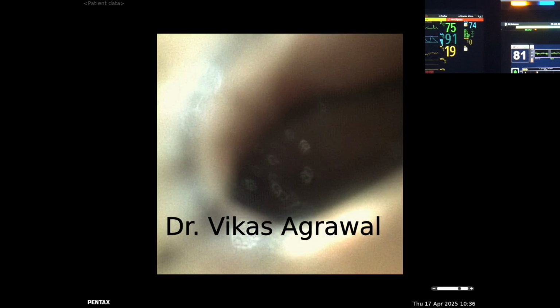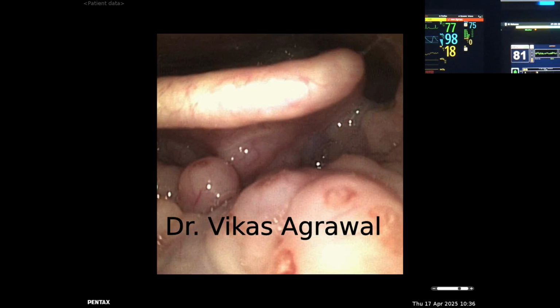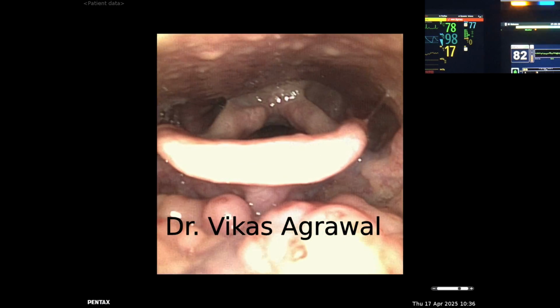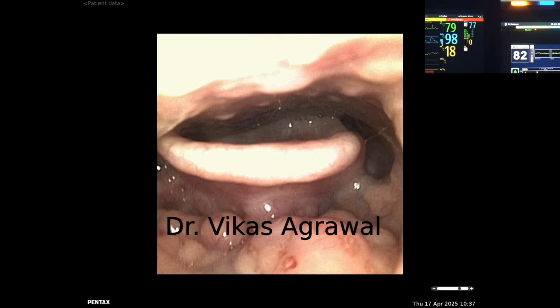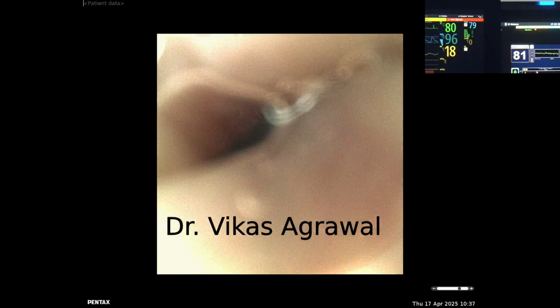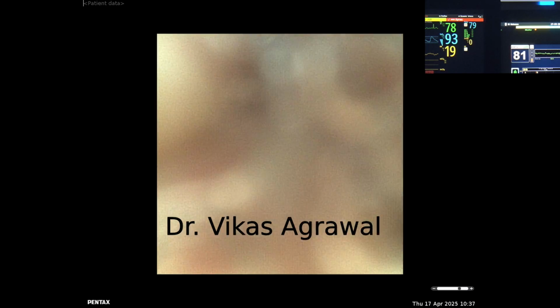There is some lymphoid tissue on the base tongue. So obviously he requires a uvulopalatopharyngoplasty with base tongue reduction and glossoepiglottopexy. As we can understand, AHI of 66, majority apneas, could not have been only because of the nose, and therefore is referred from Indore. And his primary surgery would be palate surgery and base tongue and epiglottic surgery.